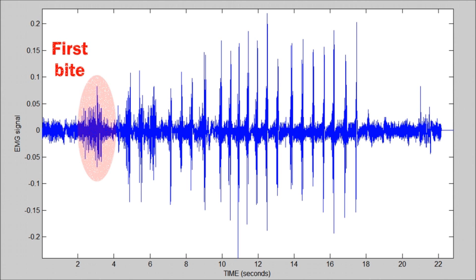The simplest form of analysis reduces this number by counting only the large regular spikes in the signal. These correspond to large movements of the masticatory muscles.